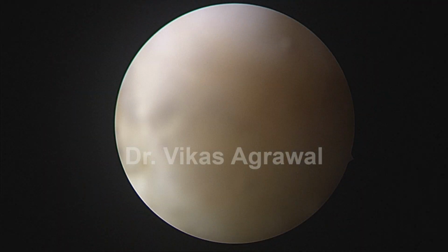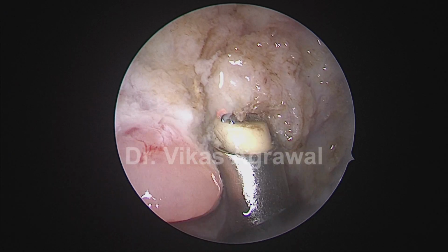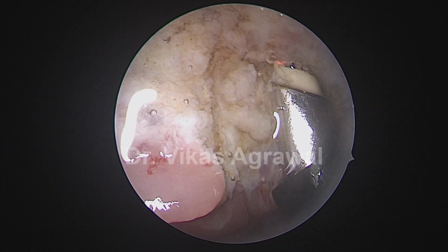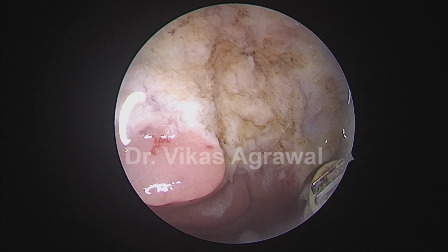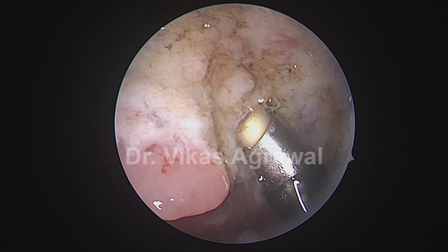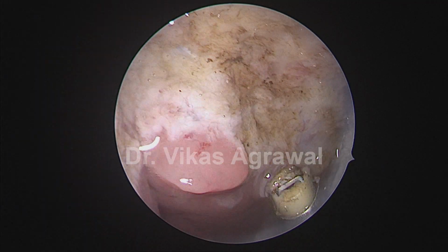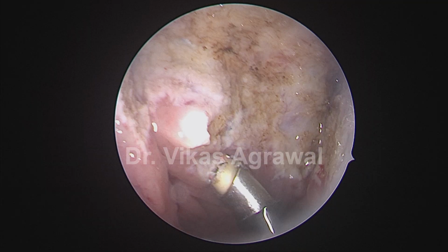Now, you can clean the tip of the scope by just touching it on the tissues as I just did, so that you don't have to come out again and again. And that's the lower part, which is the Passavant's ridge area.